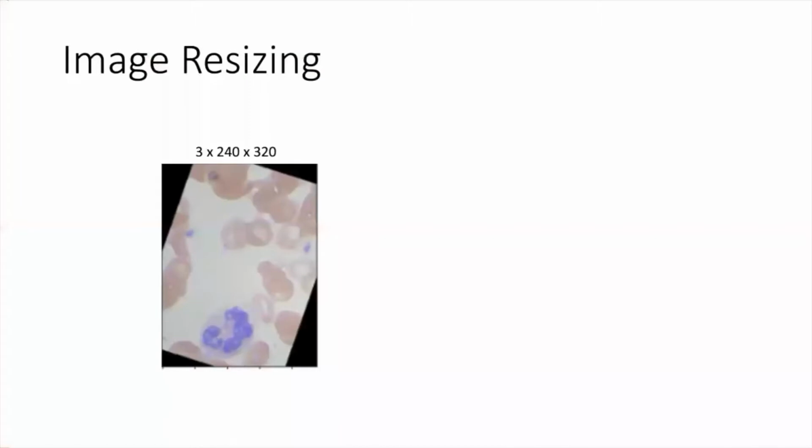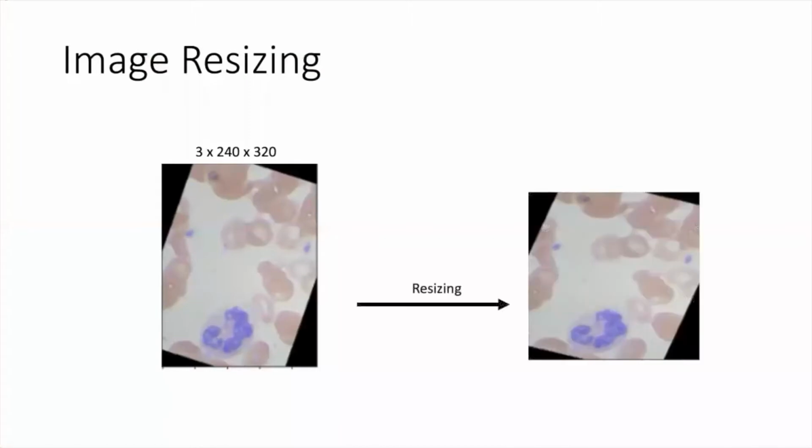First, we resized the images to a pixel size of 224 by 224 to better train our model. Later on, we noticed that the bright red blood cells in the background influenced the model during the training stage, because the identification of white blood cells is mainly based on the structural features of the nucleus. Therefore, after extensive research, we found out that contrast stretching can enhance the blood cell images.